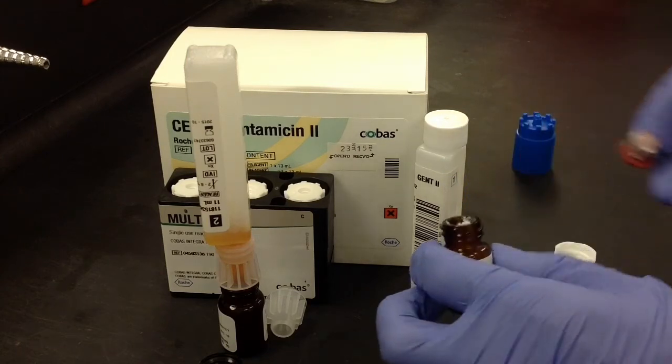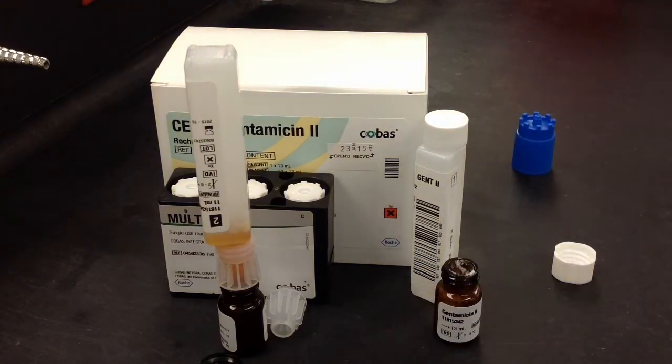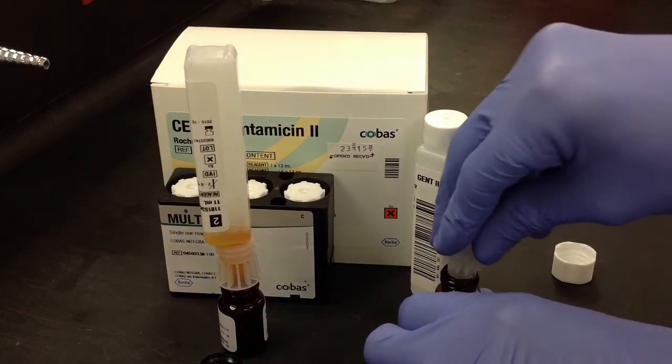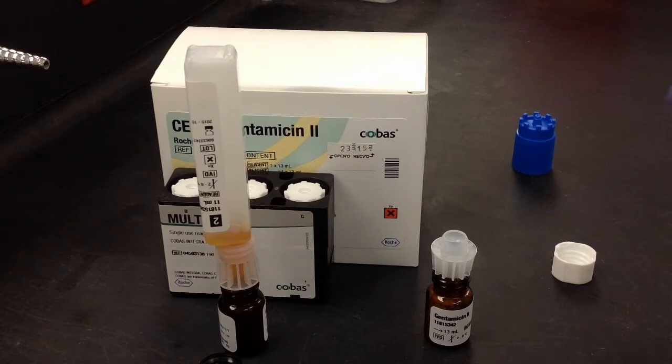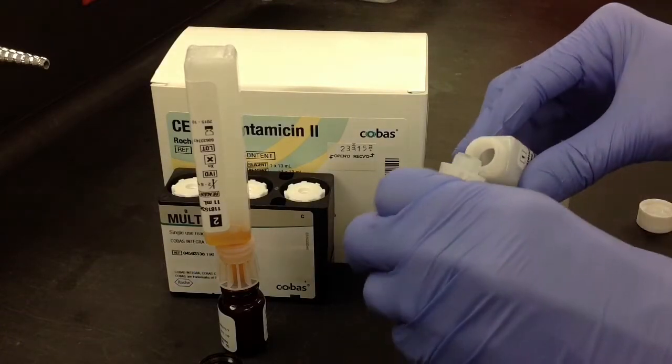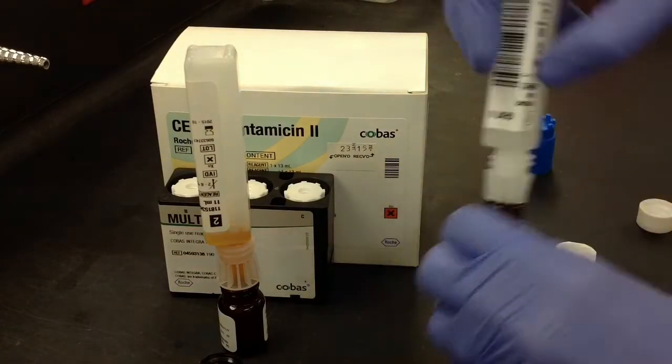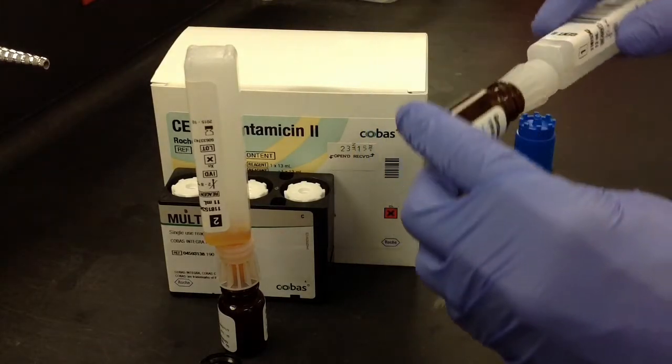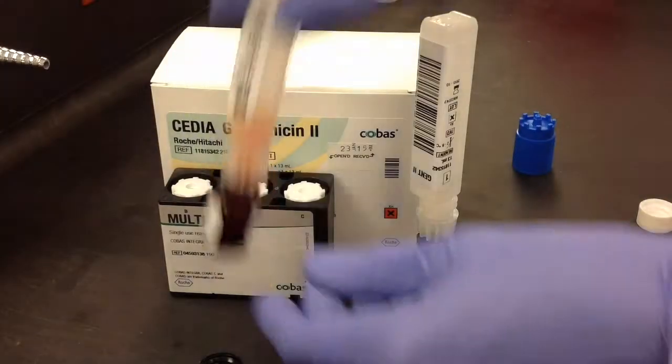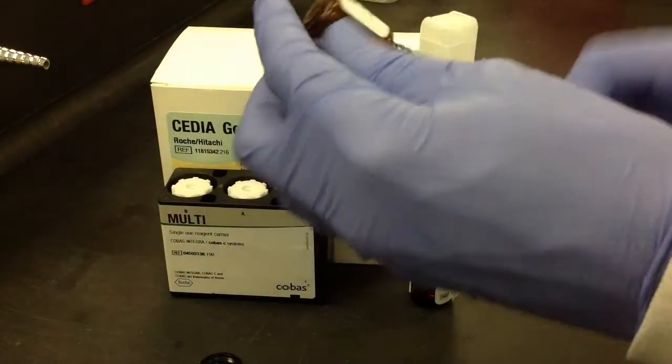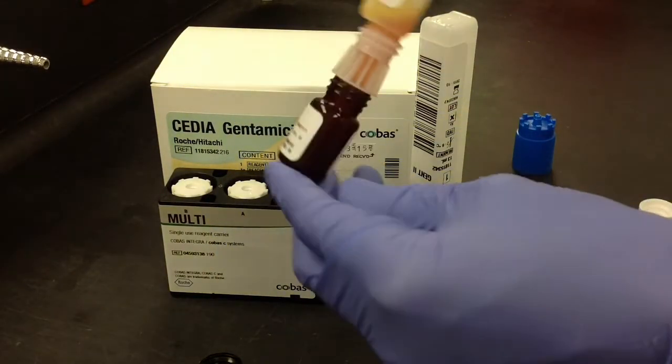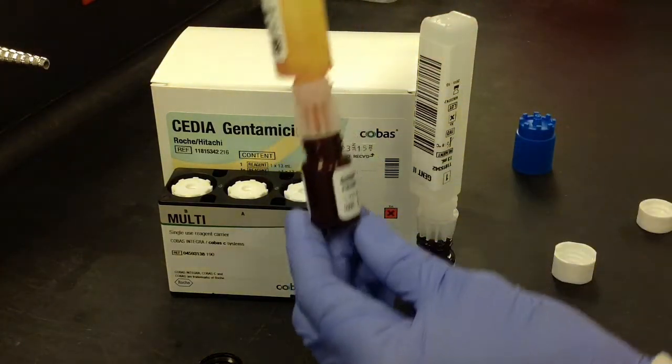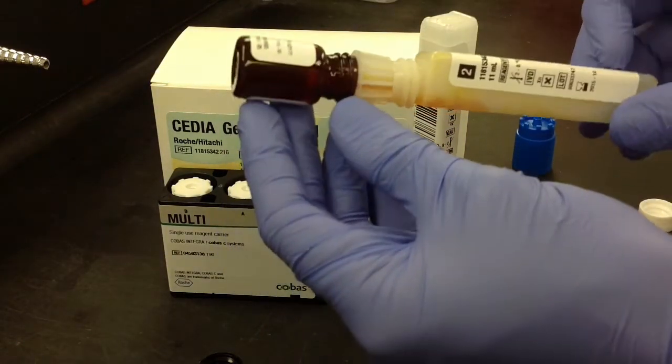So then you're going to go ahead and do the same thing with the white colored reagents. Remove the tops, attach the connector, and then just go ahead and connect them gently together. And then go ahead and give them a couple mixes. I'm just trying to get the lyophilized calibrator detached from the bottom and mixed into the liquid.